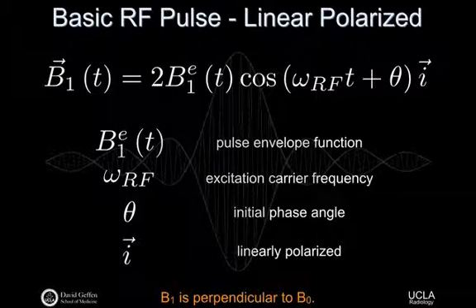Okay, so there was a fair number of questions about the current that we drive the birdcage coil with. And I said, well, if you really want to know how much current you have to put into the system, it depends on having a well-known calibration for your system. So you can say, oh, if I put this much current in, I'll get this much B1 out. Because as physicists that know MR, what we're really going to design for is how much B1 we want. I want enough B1 to tip over my magnetization by 90 degrees, or 20 degrees, or 2 degrees. And so that relationship between current and B1 is not one we can address in this class, because we're not going to get into electronics and system design.